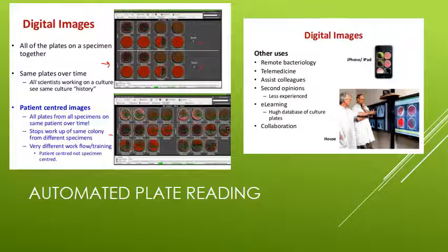And at the same time, of course, having all these digital images allows us to collaborate over space and time with other hospitals, with pathologists, with other professionals. It gets us second opinions or assistance from our colleagues. Do you think I should work this up? And one of the things they're really pushing is, look, they can send it to the doctor's iPhone or iPad.